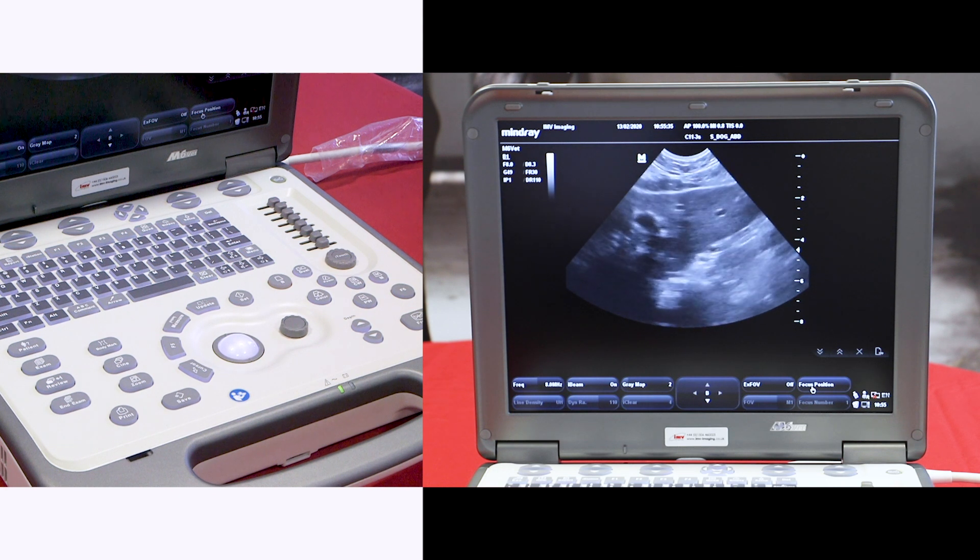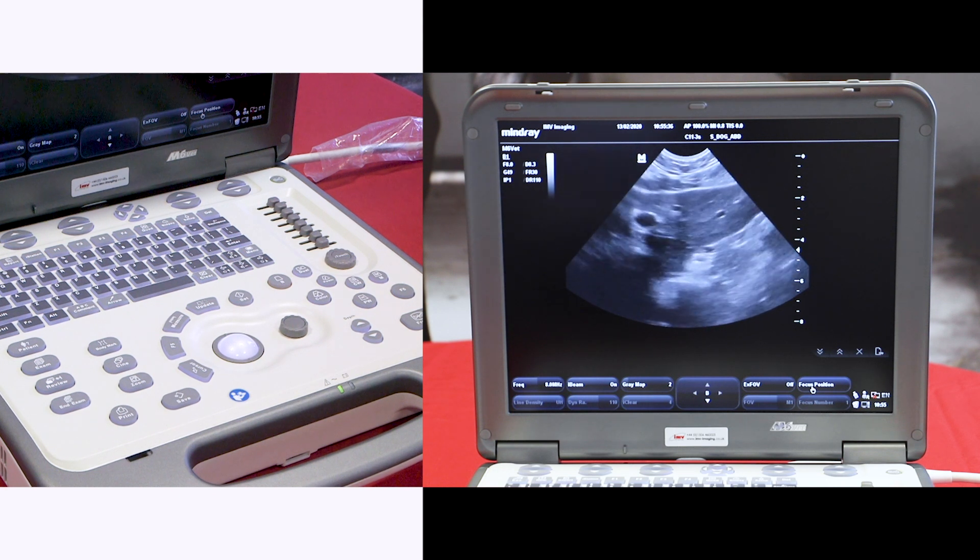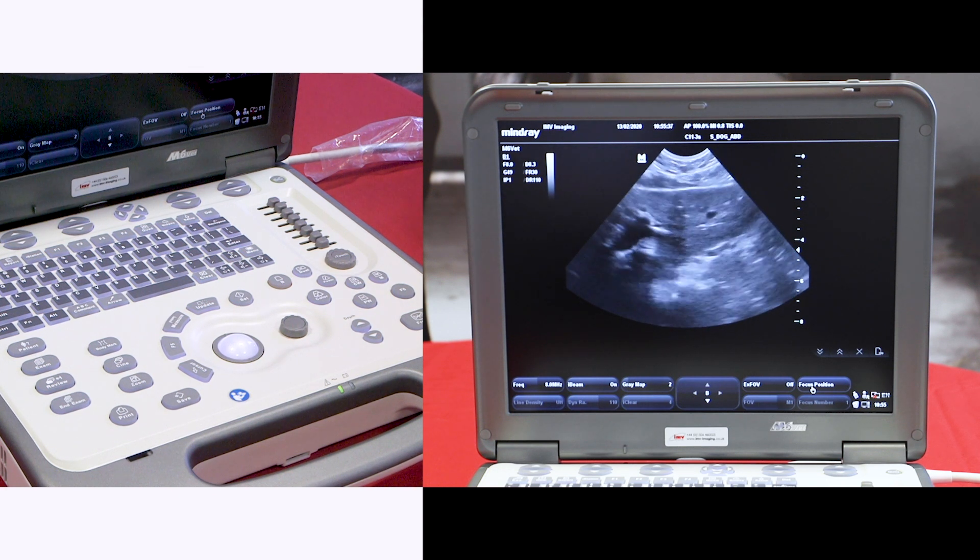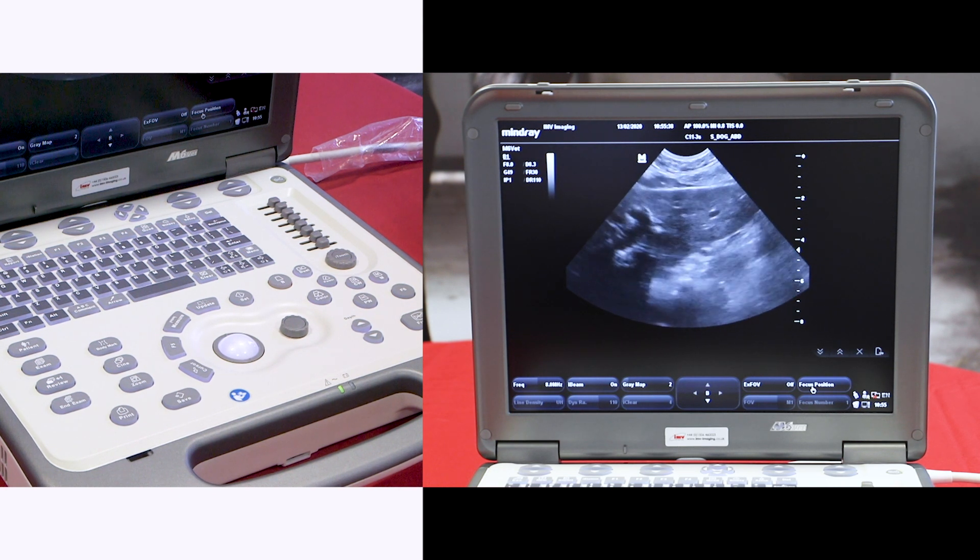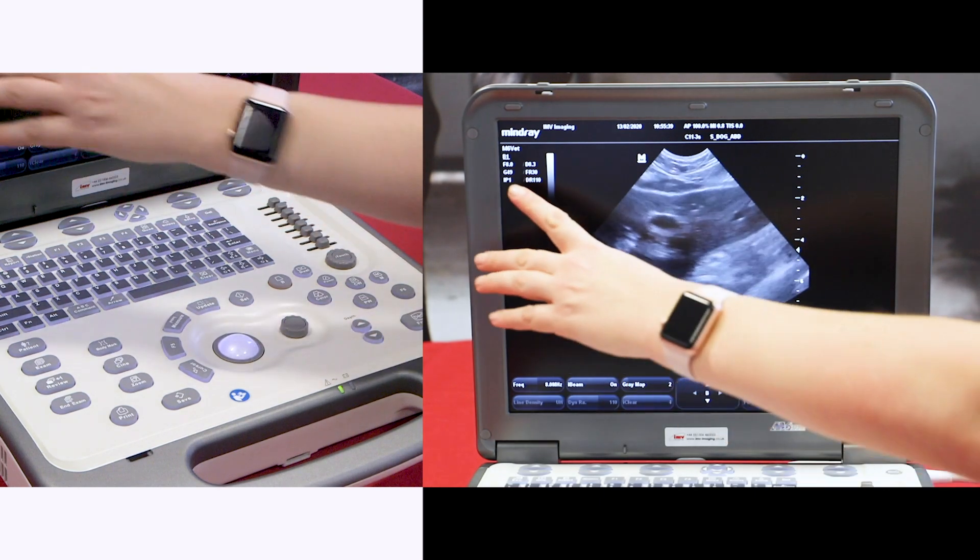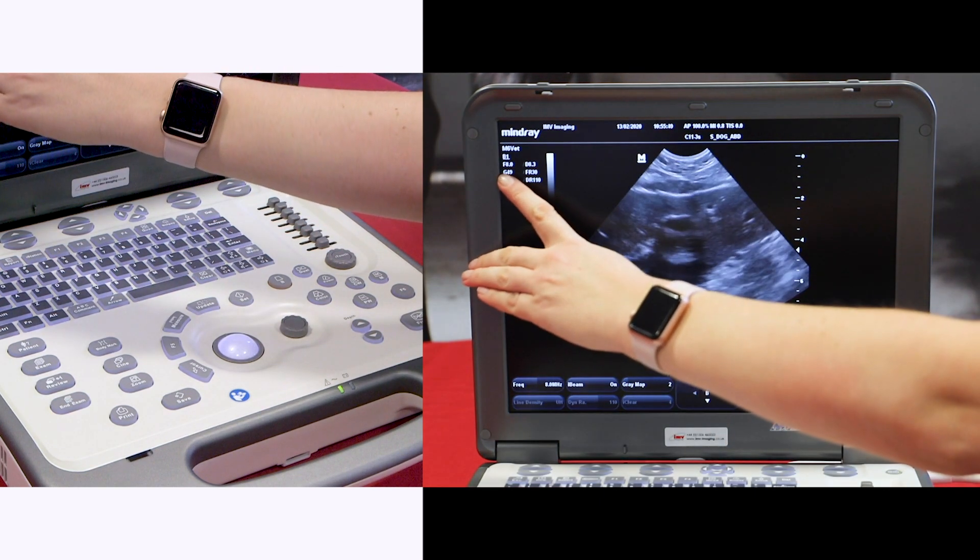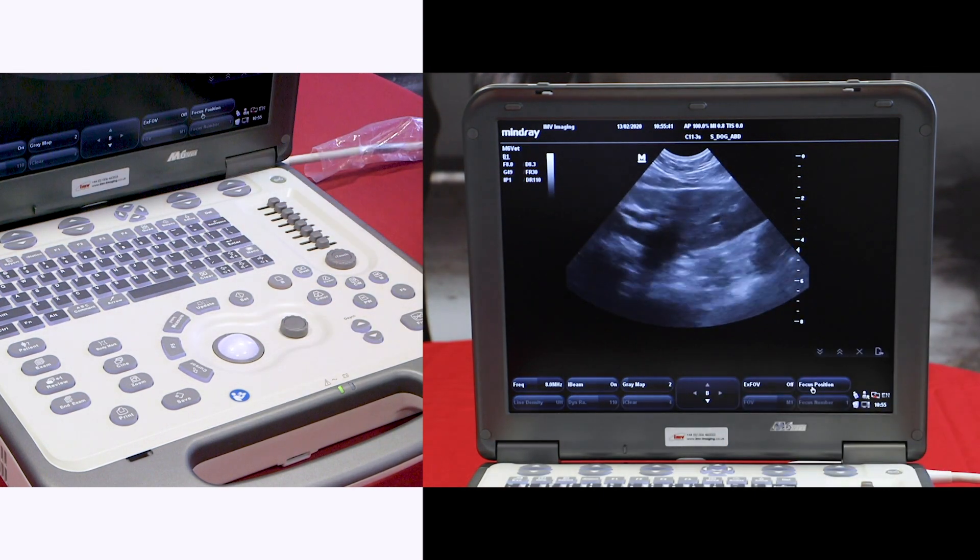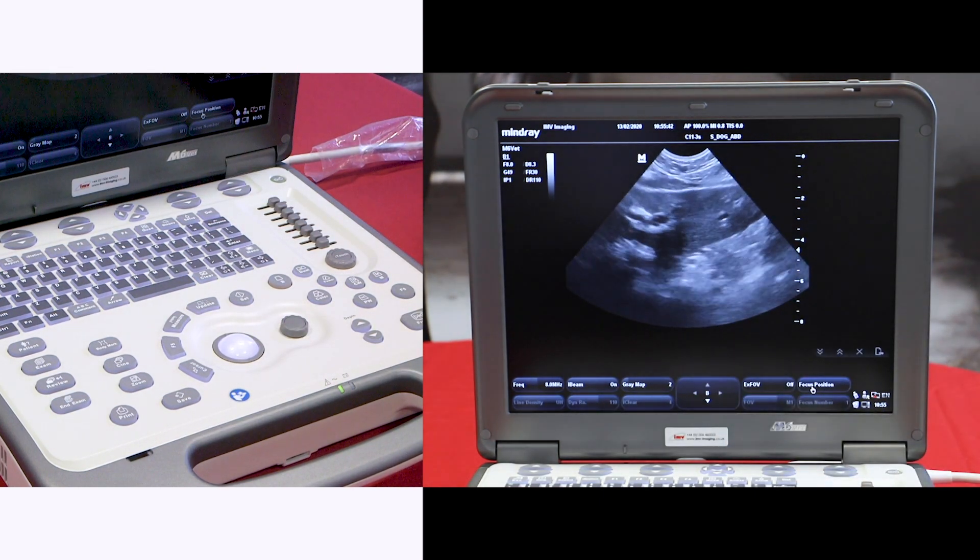The first thing I like to check is the gain. This is the overall brightness of the image. On the screen here we have a gain level of 49.